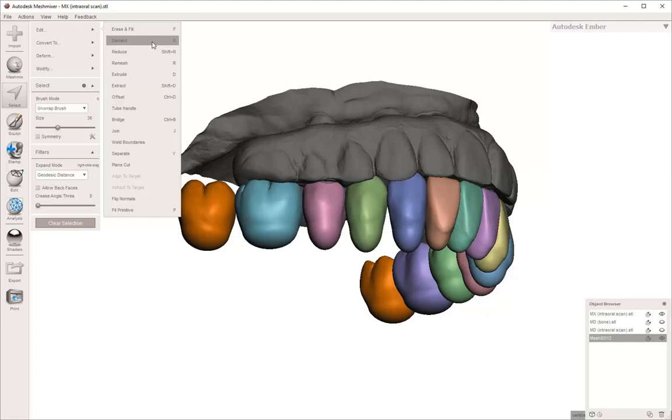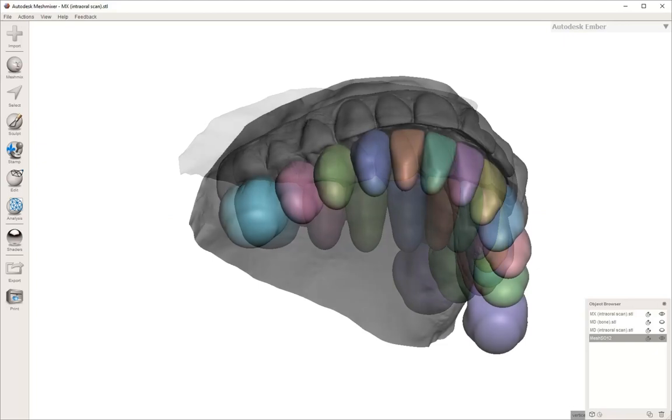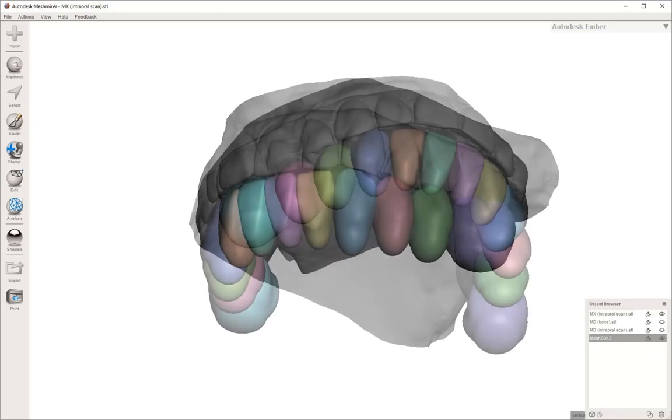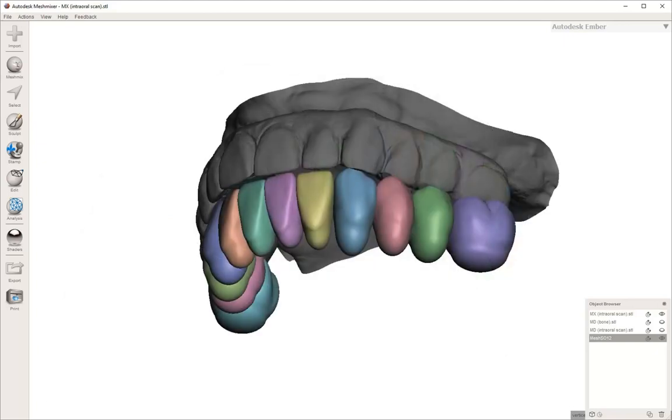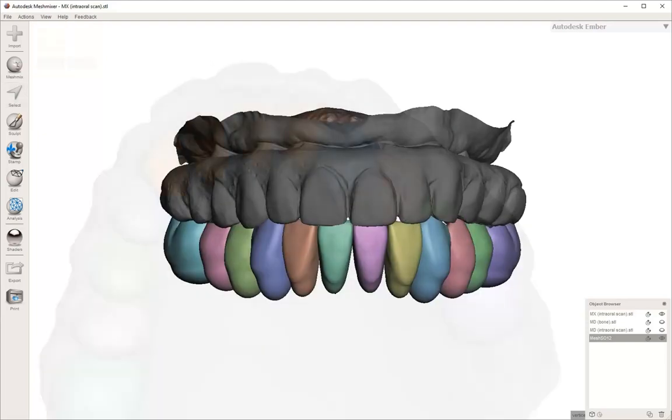And this time, then you can either hit X or delete on the keyboard or just choose to discard. Once those are gone, you can spend some time just refining and going through and getting the teeth set in a more appropriate position.